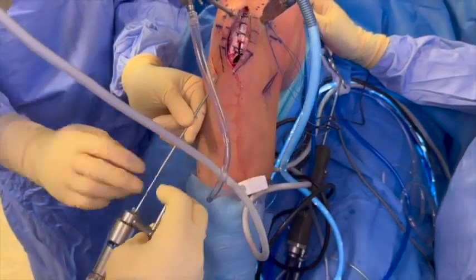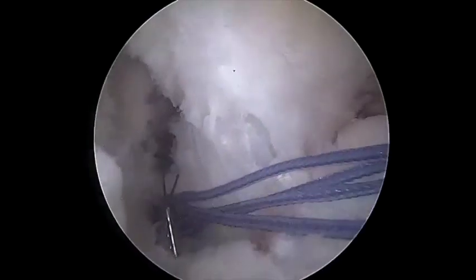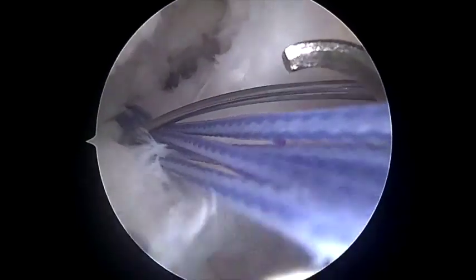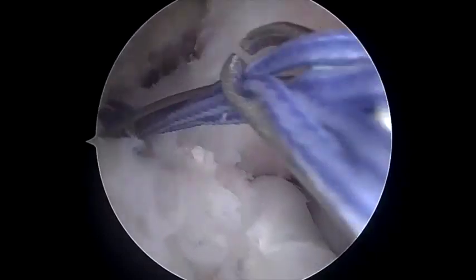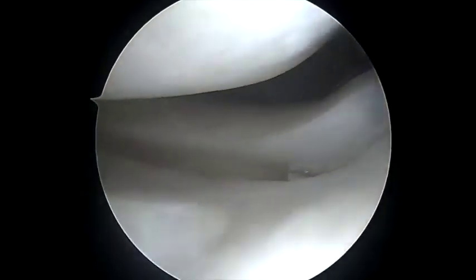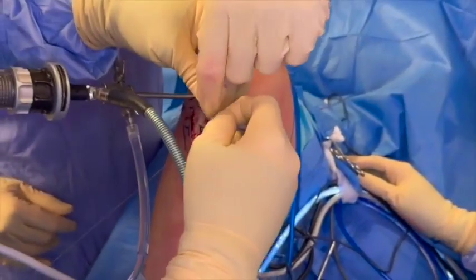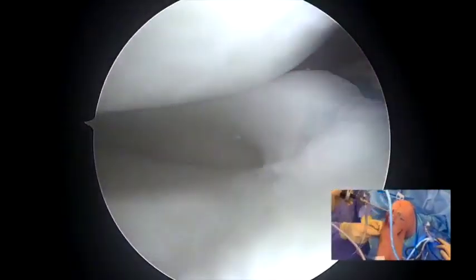The tunnel is created by passing a 4.5mm reamer over the k-wire. The k-wire is removed and the reamer is used as a guide to introduce a metal loop suture relay into the joint to be retrieved from the anteromedial portal. A loop grasper is used to untangle the sutures and then the free ends of the four sutures are retrieved from the anteromedial portal. The free ends of the sutures are carried on the loop of the metal wire relay and then pulled into the tibial tunnel through the carrier wire.